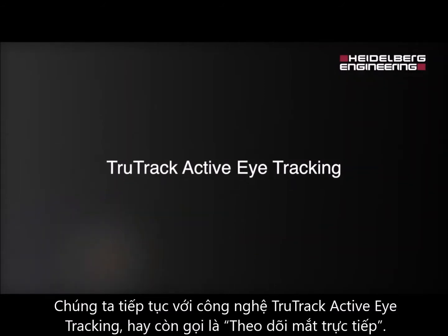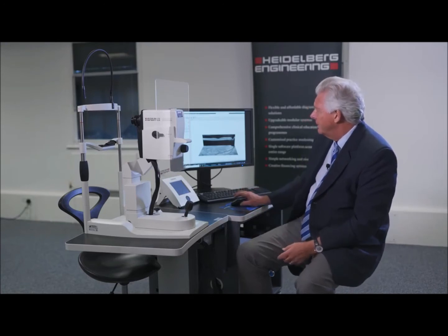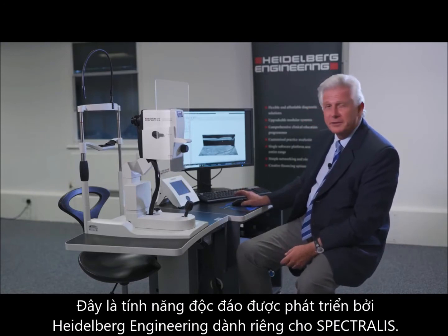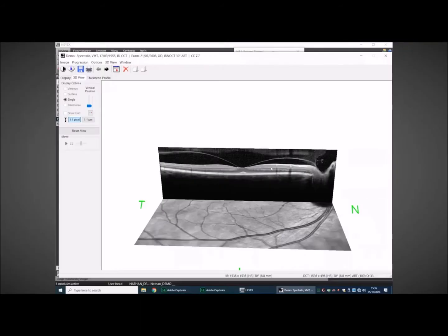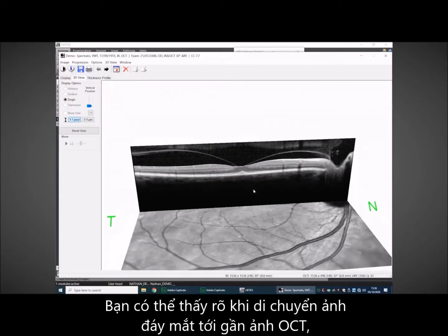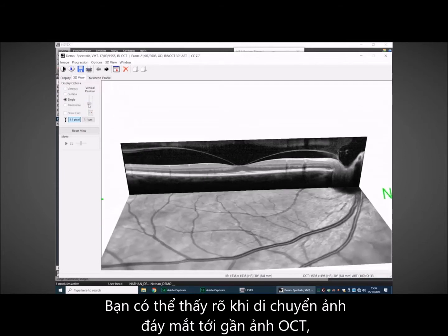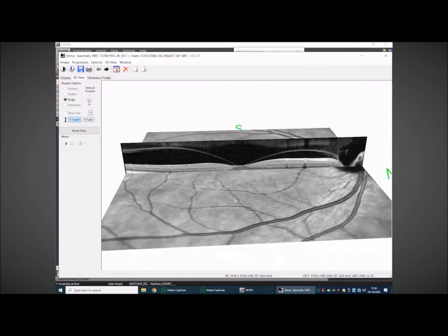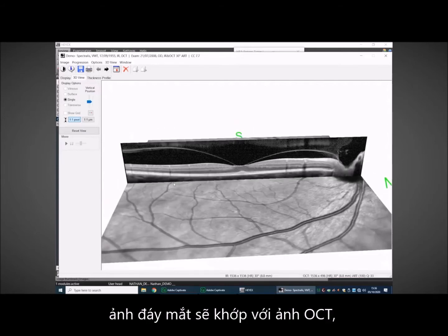And this brings us to TruTrack active eye tracking, or live eye tracking. This is a feature that was developed by Heidelberg Engineering for the SPECTRALIS, and you can show this very nicely if we move our fundus image up close to our OCT. You can see how exactly the fundus image aligns.